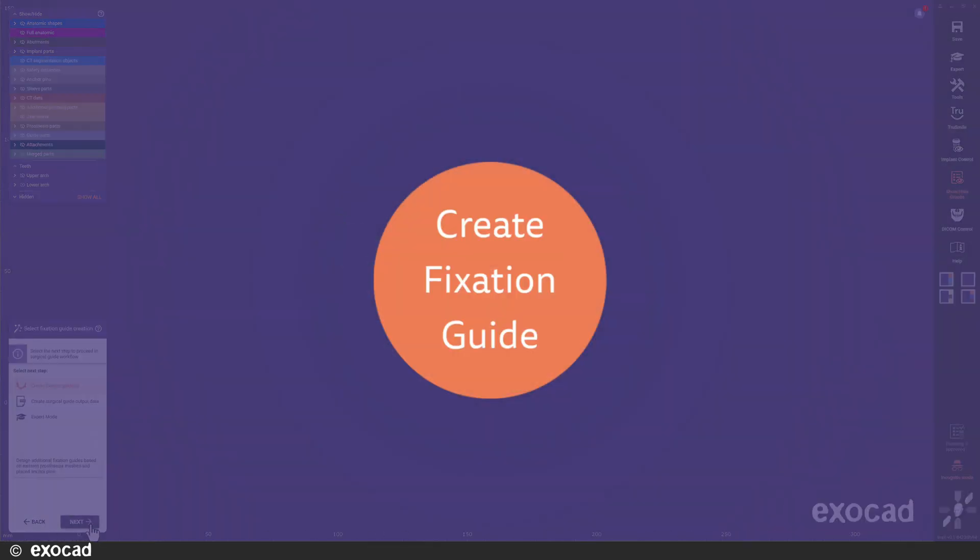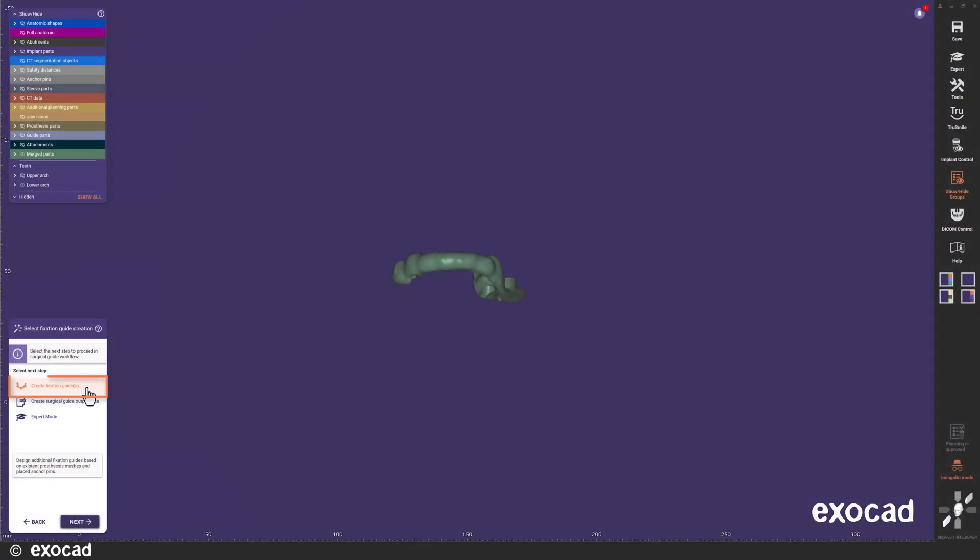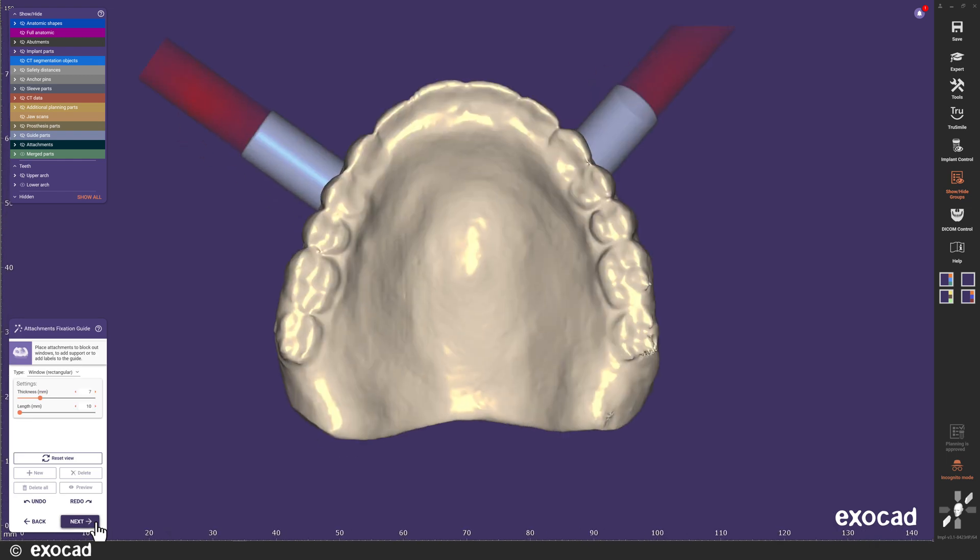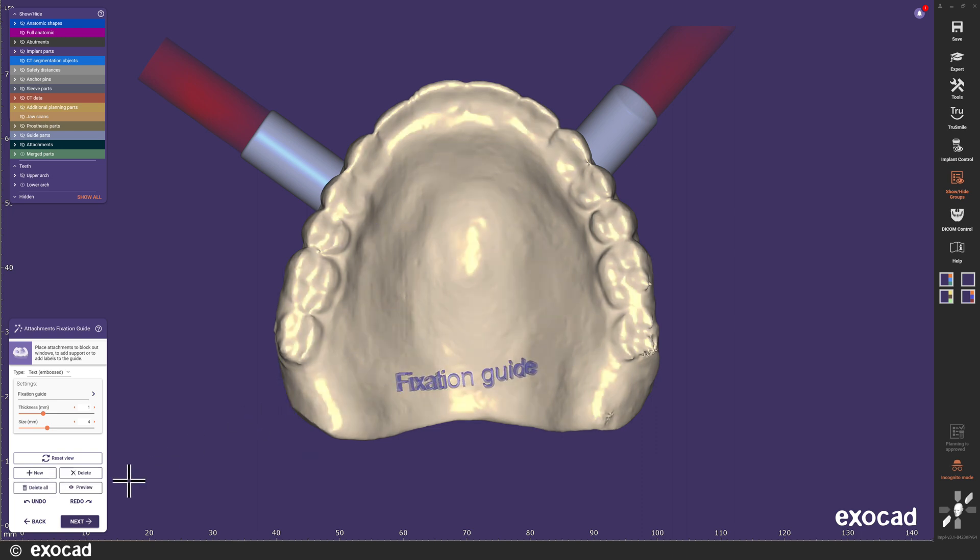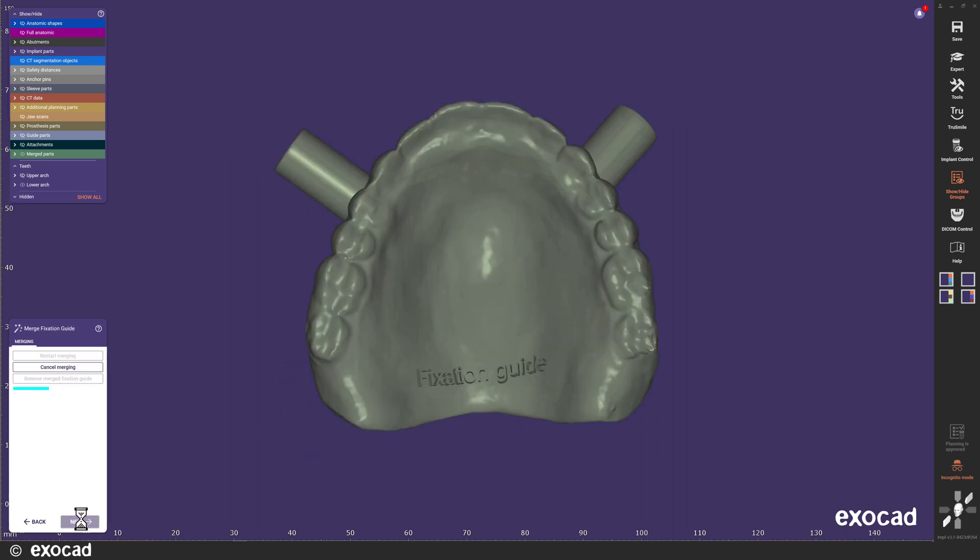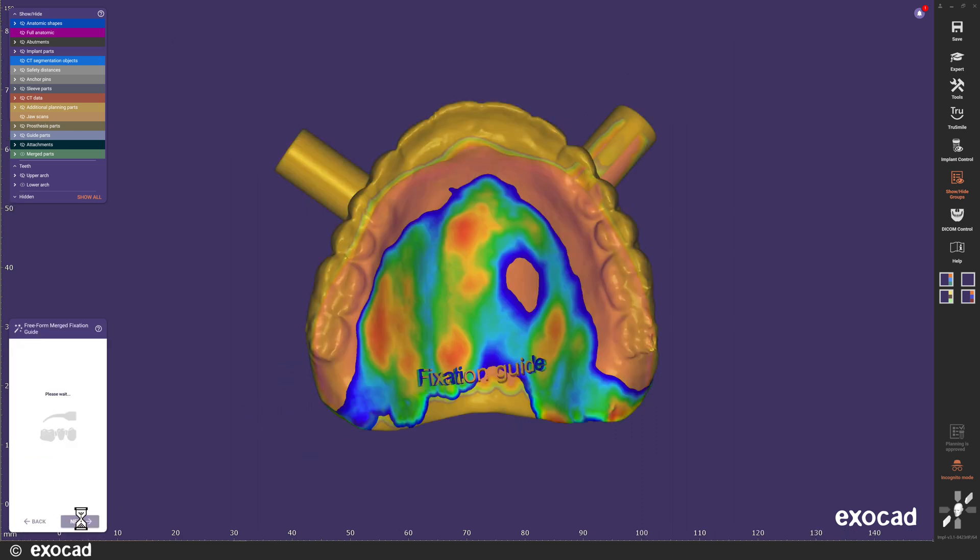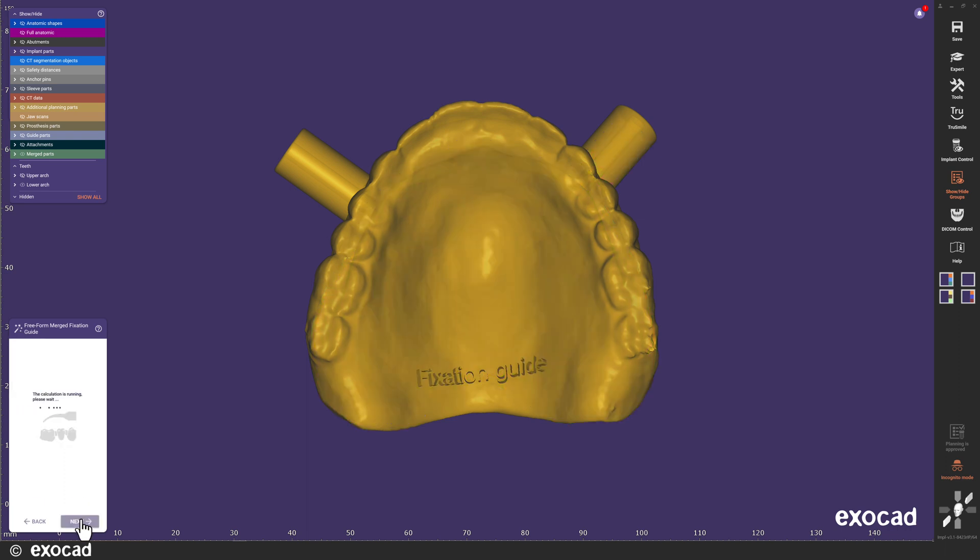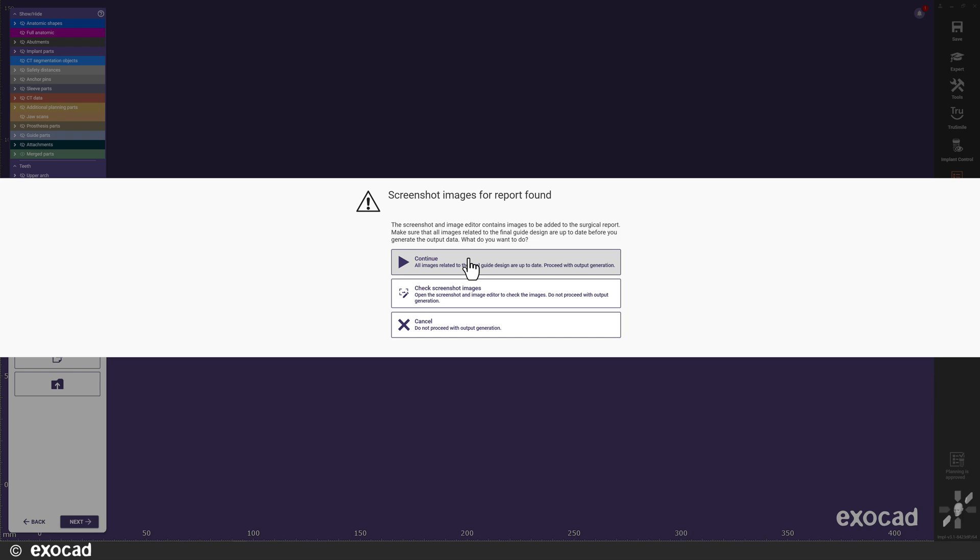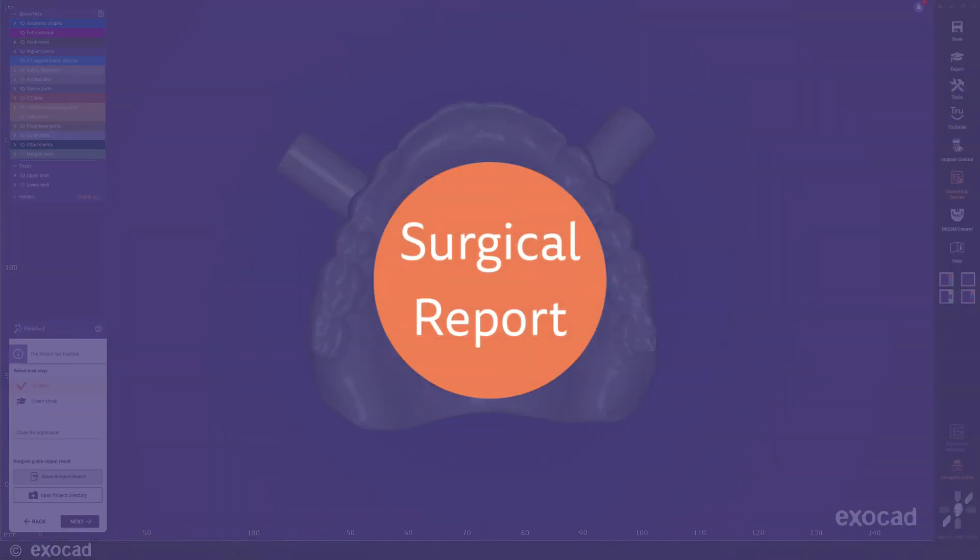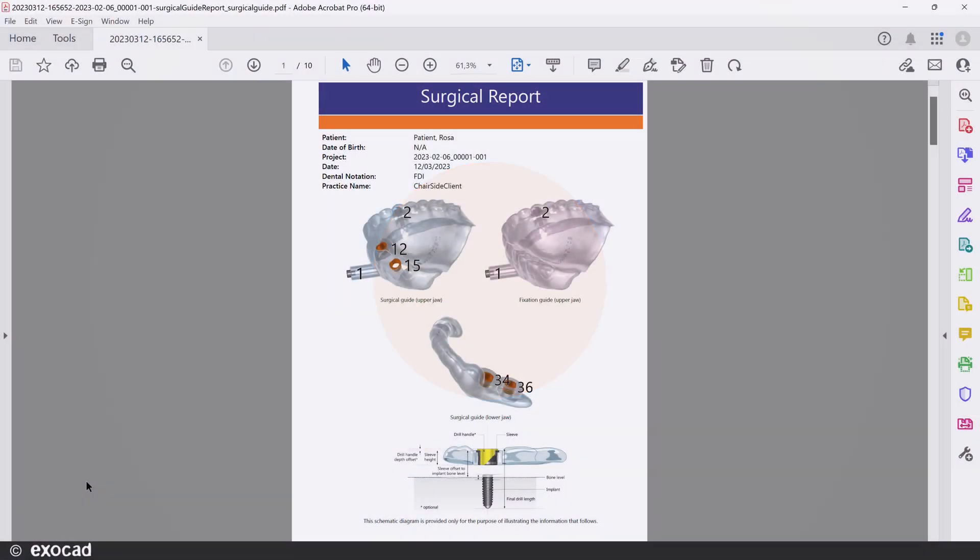When the merge has finished, I can do some free-forming of the merged surgical guides if I'd like. For the edentulous upper jaw, I will select to create a fixation guide. Here, I can place attachments to the fixation guide, and then continue to merge this guide as well. Free-form the fixation guide if you'd like. Before I start to generate the result files, I get the chance to check that the screenshots I marked to add to the surgical report are still up to date.